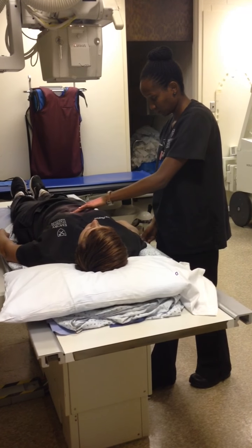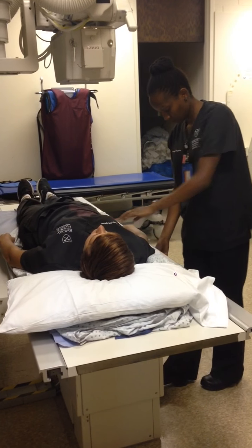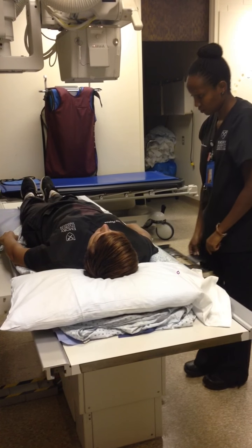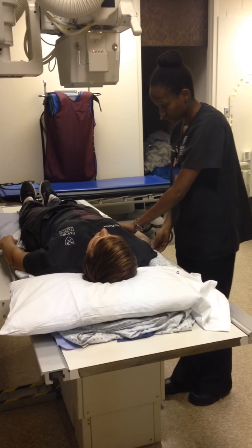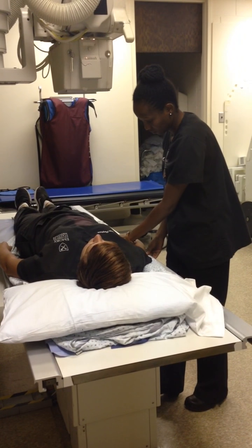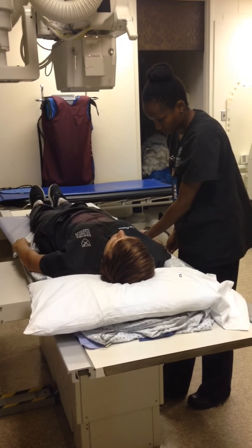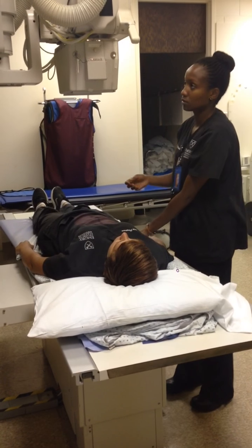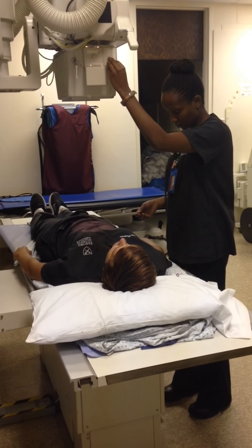The cassette is 14 by 17 lengthwise with a fully open light field. The central ray is perpendicular to the image receptor at the level of L1 and L2. Centering left to right is halfway between MSP and the lateral border of the abdomen on the left side. Centering top to bottom is halfway between the xiphoid tip and the lower margin of the ribs.